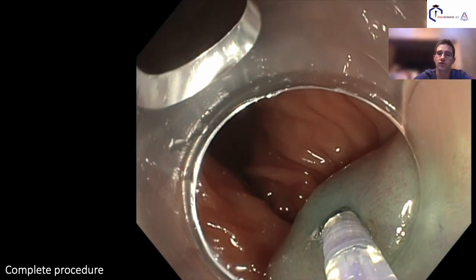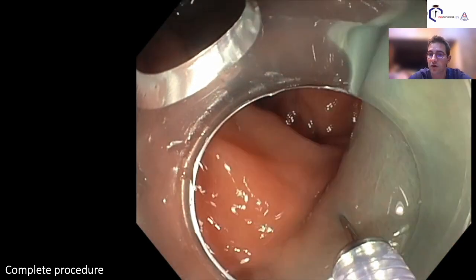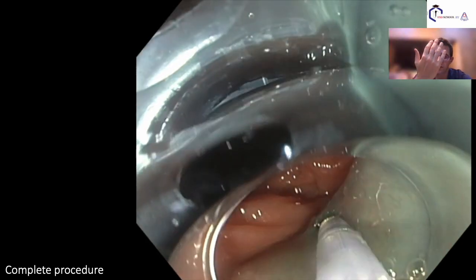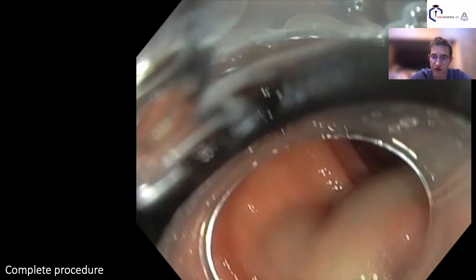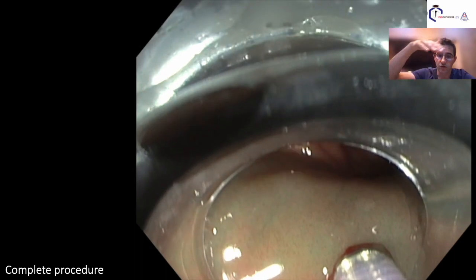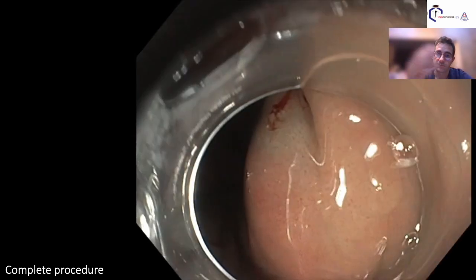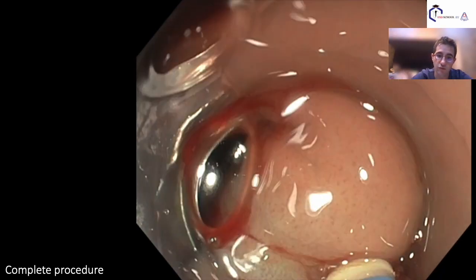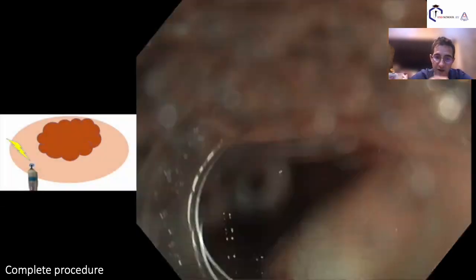You will turn it to face you, and therefore, as we discussed in the episode about injection, you will have the mucosa facing you at a 90 degree angle, and it will be easier to make a deep incision with strength if you do something that faces you instead of something that goes down, like the downhill of a mountain. Here you increase the size of the oral side in order to face you and to have a good incision and relatively good access to the submucosa.